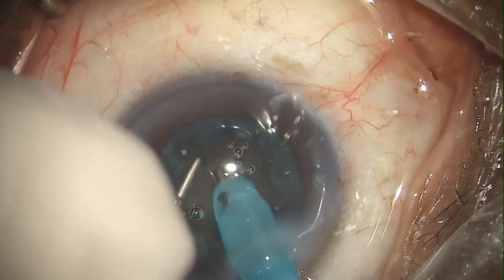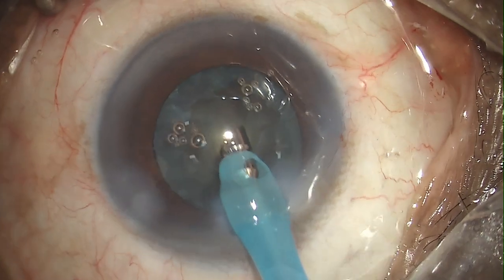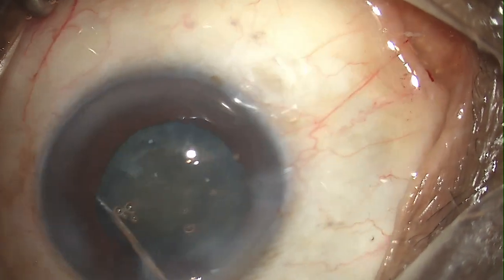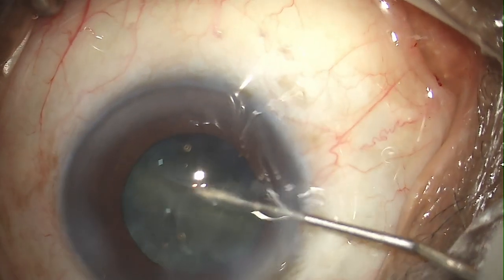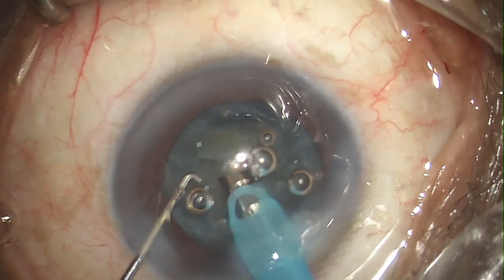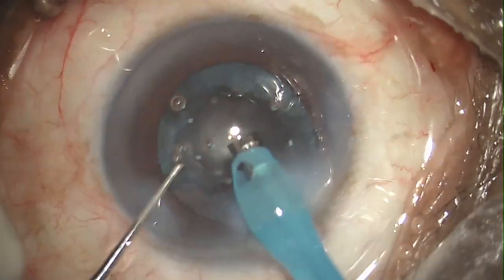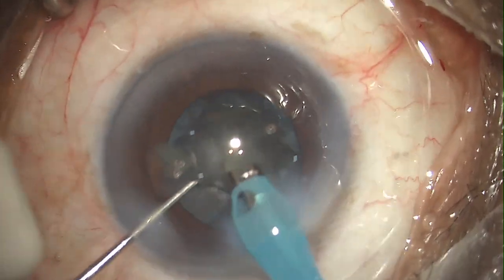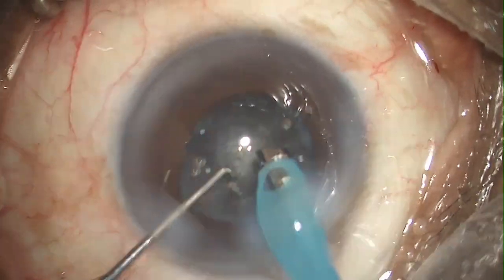In such a scenario where you feel stuck and nothing much is happening, it's better not to play around with the phaco probe — instead go with the hydrodissection cannula, inject saline, get the nucleus into the anterior chamber, and emulsify it easily. Always try to use your second instrument — whether it's a chopper, a Sinskey hook, or a spatula — to get the stuck pieces into the iris plane and help the phaco probe emulsify the pieces easily.